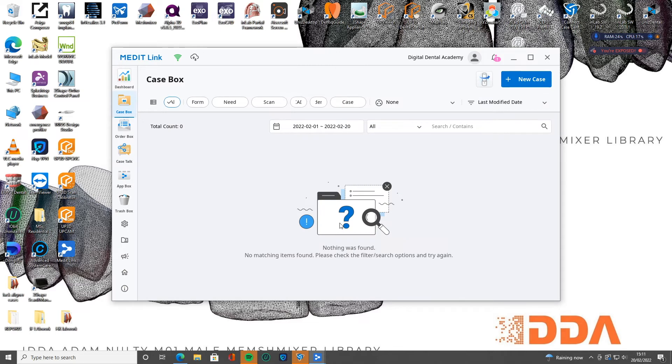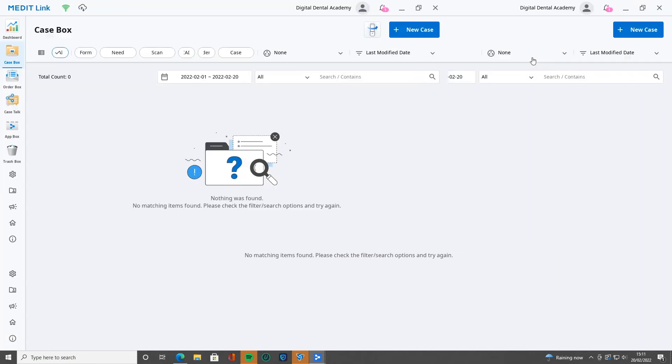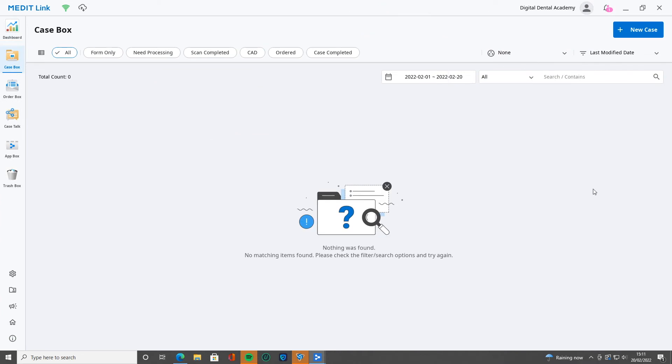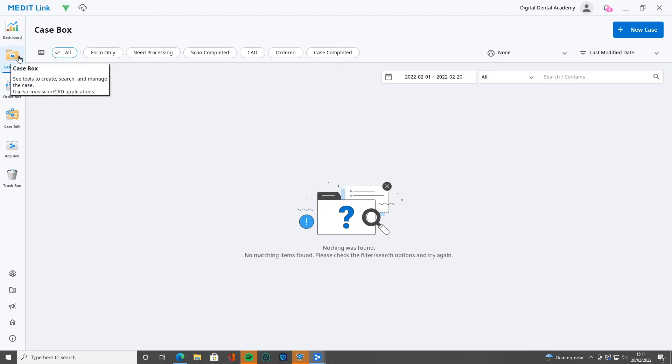So first things first, let's have a look. I've logged in here, let's maximize this. I'm going to just give you a brief overview of what you see and all of these different settings. When we log in, we see the case box. This case box is going to list all of your patients that you've made, that you've scanned.